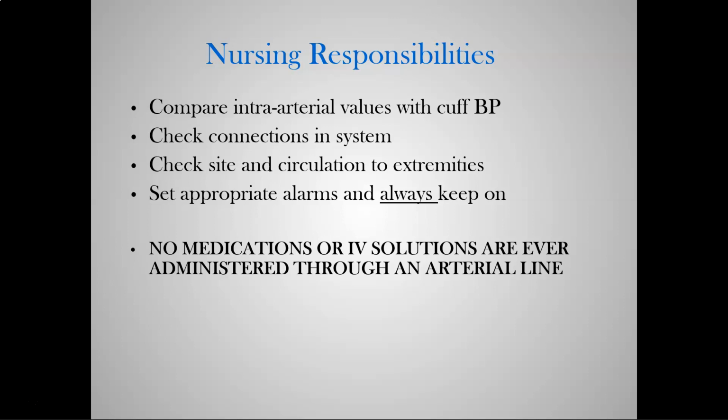And what I mean by that is you open the stopcock or the valve and you leave it open. Now, obviously, your line on the monitor will go completely flat because it's not going to measure anything, because it's closed to the patient or open to the atmosphere, whatever the case may be. You need to troubleshoot that.